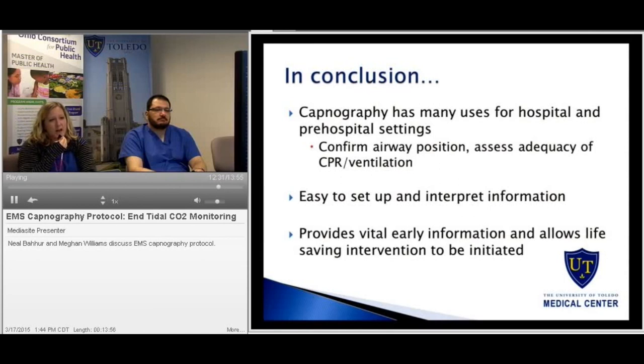It will also assess the adequacy of CPR and ventilation during the resuscitation period, also very important for your patients. It's very easy to set up and interpret the information instantaneously. You can watch the procedural video that follows this one, and you'll be able to see that, yes, indeed, it is very easy, very user-friendly. And lastly, it provides vital information early on in the assessment period, and it allows for life-saving intervention to be initiated more quickly in the resuscitation period, hopefully giving the patient a better outcome in the end.